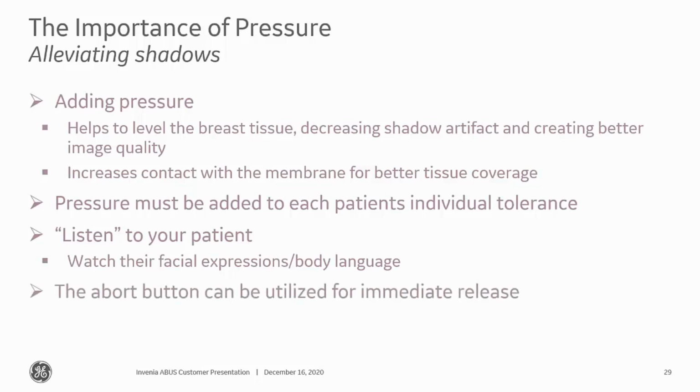If there are issues, if the scan starts and they are struggling with discomfort or having a coughing fit or whatever situation may create image artifact, you can hit that abort button, and that will immediately release the pressure and stop the scan. Remember, on that abort button, you have to hit it a second time to recalibrate the system to make sure it's ready to go for your next view.